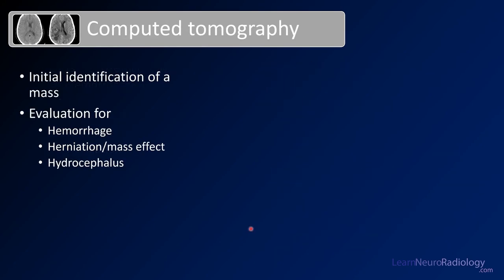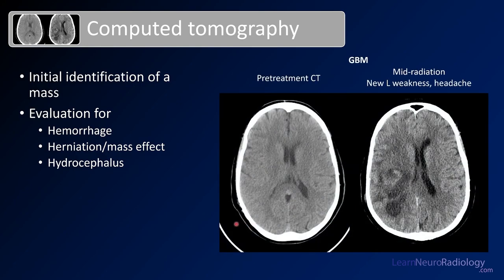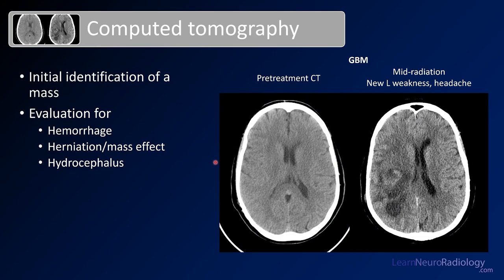CT is for initial identification of a mass, evaluation for hemorrhage, herniation or mass effect, and hydrocephalus. Here you see a patient with a glioblastoma before they started treatment. On CT you don't really see a whole lot — pretty symmetric ventricles, maybe a little mass effect on the occipital horn of the right lateral ventricle. Then the patient came in during radiation therapy with new left-sided weakness and headache, and there's a lot more edema in the right cerebral hemisphere, maybe some areas of hemorrhage — complications with worsening mass effect.